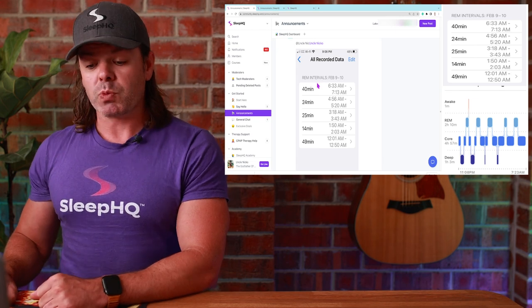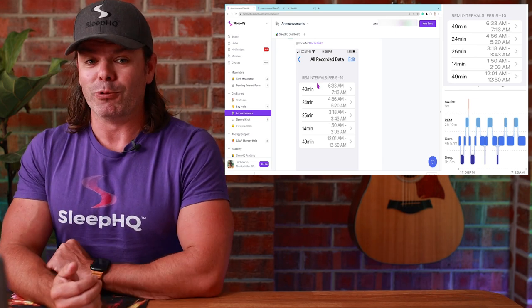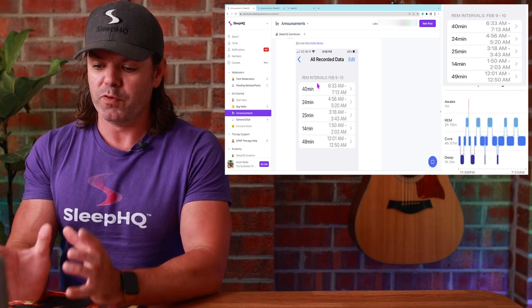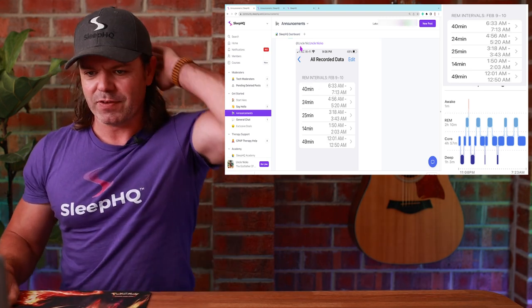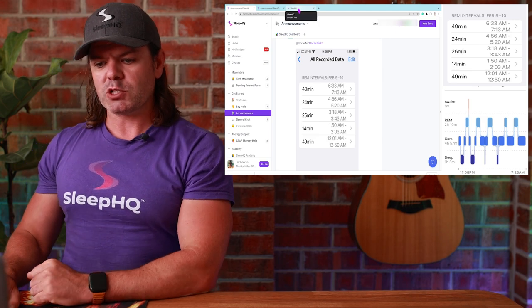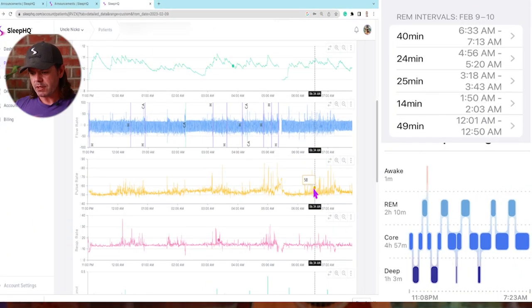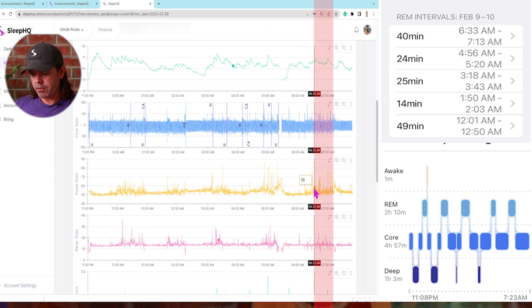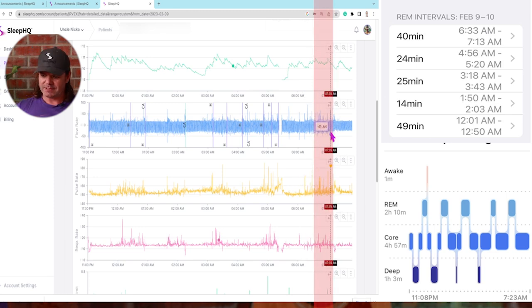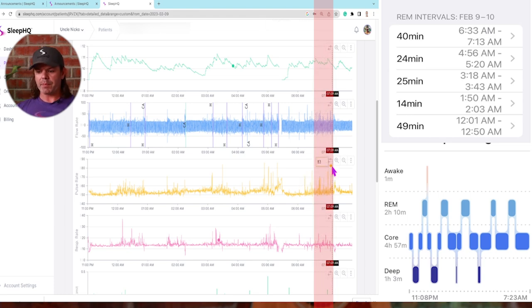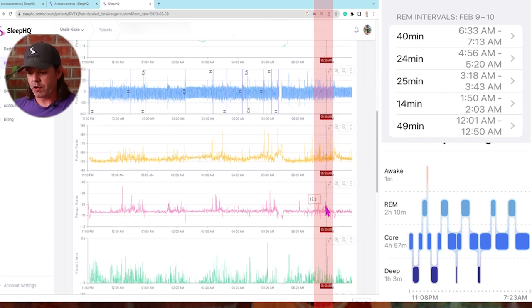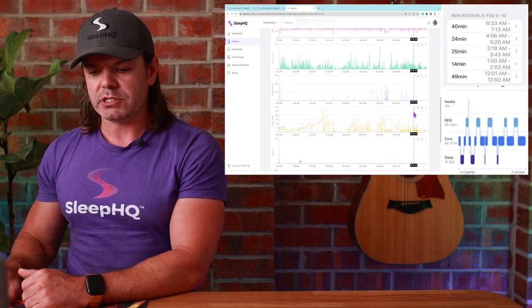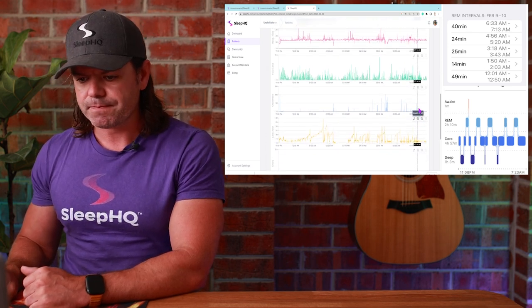And then the last one, 40 minutes. Man, this is a damn good sleep cycle, I gotta say. Look at these beautiful, big, healthy chunks of REM. Great stuff, I love it. 40 minutes, and the last one, 6:33 to 7:13. 6:33 here, to 7:13 here. There's the last one here, you can see. Once again, pulse rate becoming very erratic. Jumping up here, 83 beats per minute. We've got the respiratory rate becoming erratic. We've got the increase in flow limitation. Is there anything else we can talk about here?